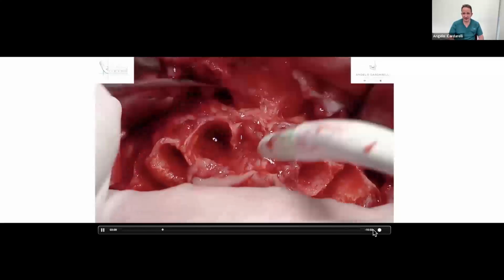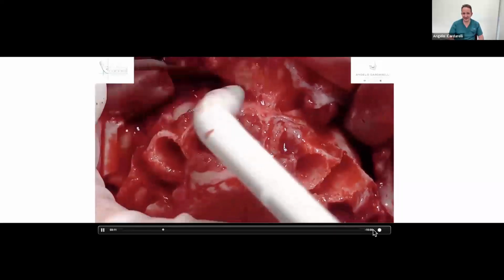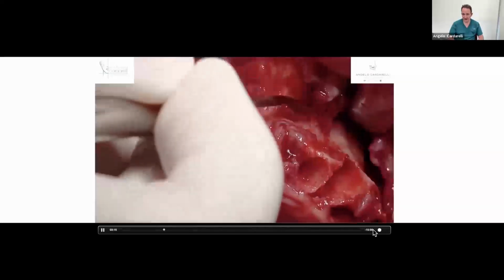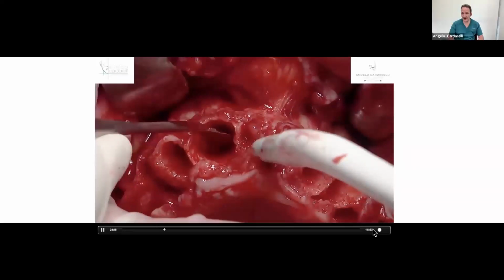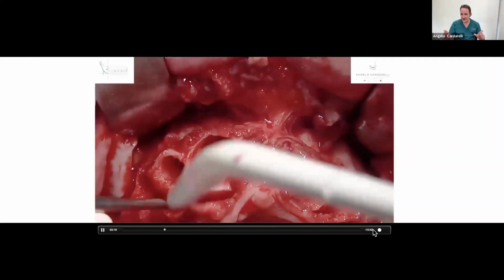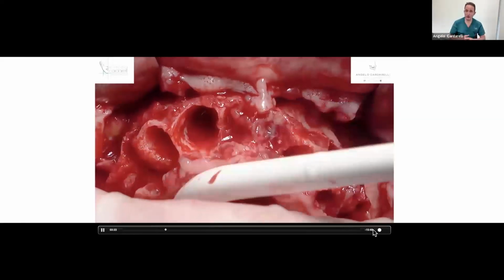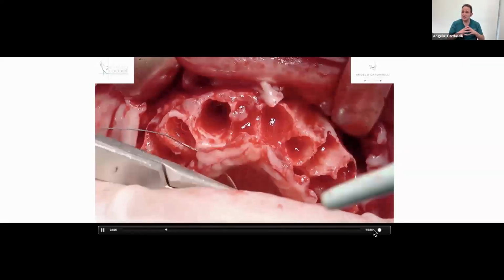At that time here, you can see the nasal area, okay? So we are in the nose here. So we have enough bone in the thickness, but we don't have enough bone in terms of the height. So we need to clean more. This view is not enough.